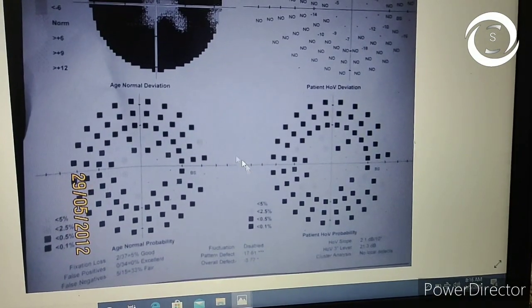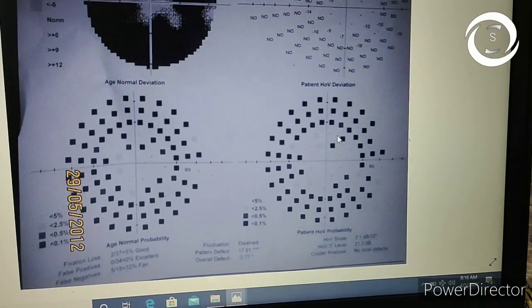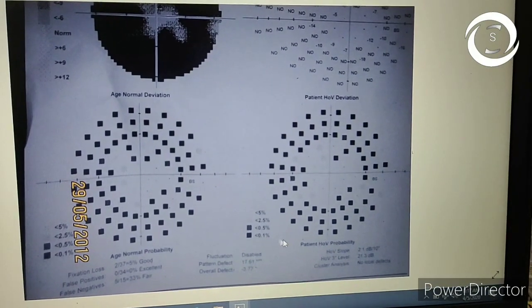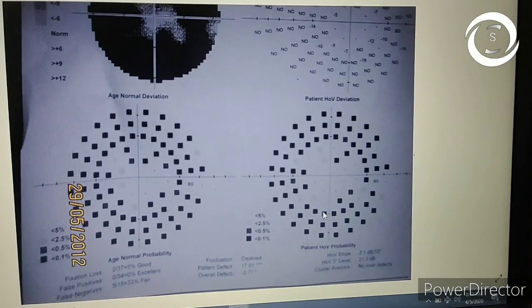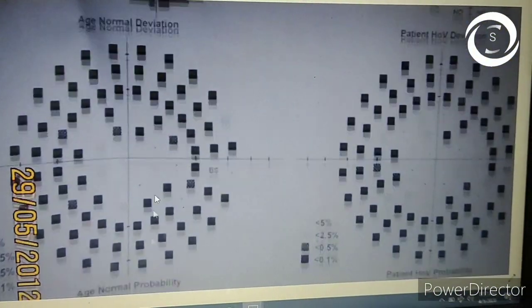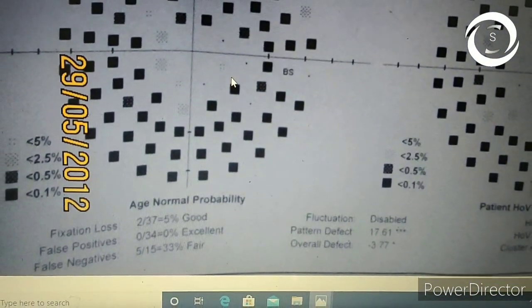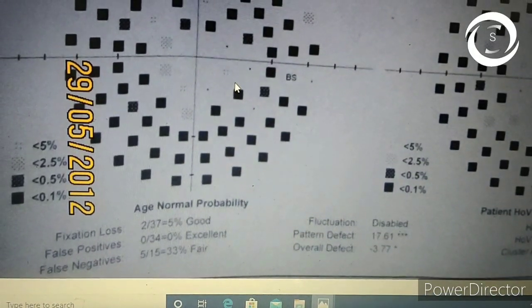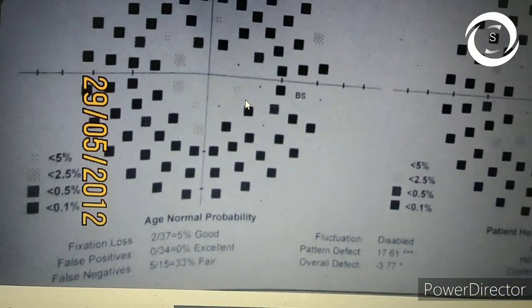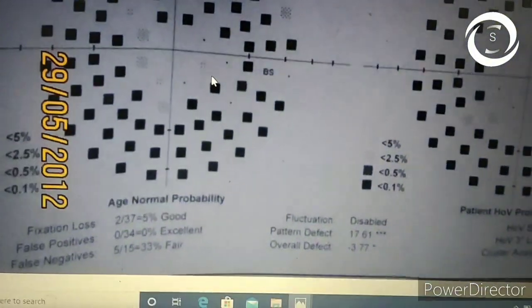Here the total deviation is called the 'age normal deviation,' and you can see only the center is preserved while the periphery has dark spots. The pattern deviation shows no generalized depression, indicating a ring scotoma. The reliability indices — fixation losses, false negatives, and false positives — are within the normal range. False negatives are 33 percent but still within acceptable limits. This represents advanced glaucomatous damage with ring scotoma.